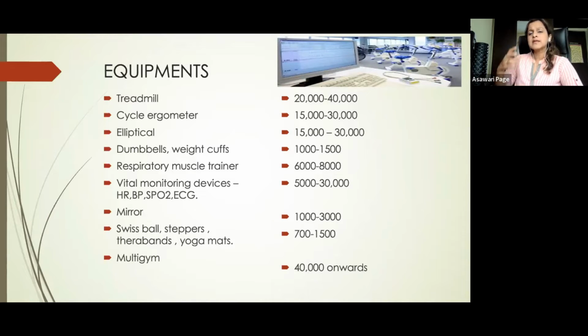But these are the basic equipments, and the pricing ranges from region to region and from company to company. So there's a wide range of prices right there. So you'll have to really sit down and work out what your budget is, how much space you have, how you want to lay it out, and how many equipments you want to take, and then accordingly place them. But I think these are the basic equipments that you need, along with the emergency equipment if it is going to be a standalone center.